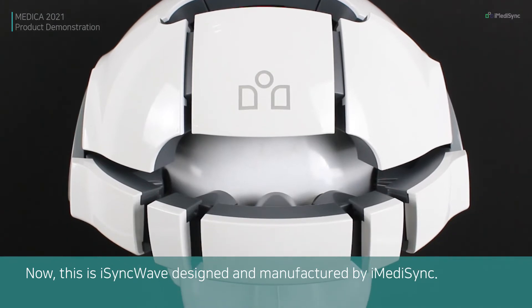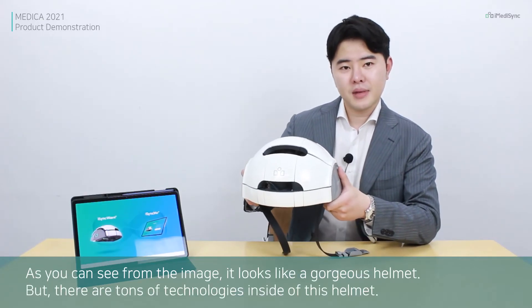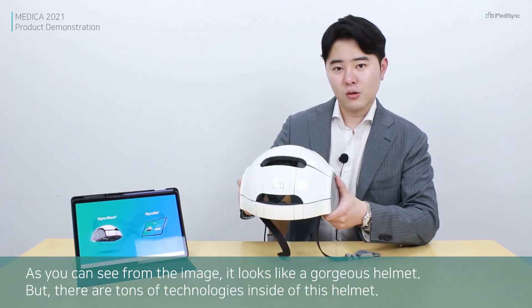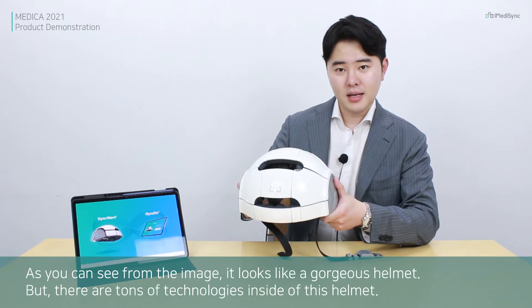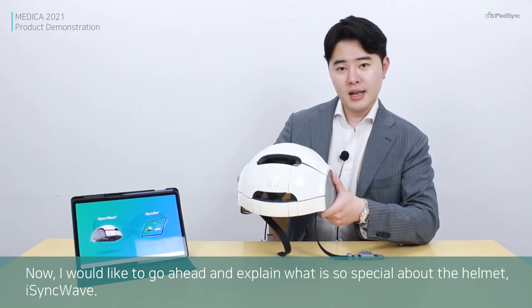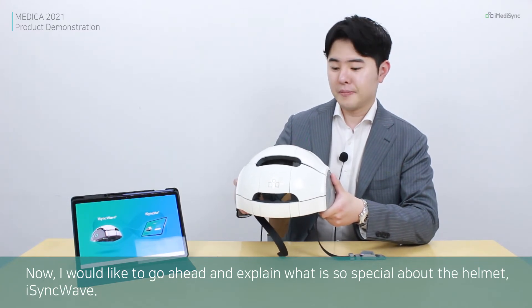This is iSyncWave, designed and manufactured by iMediSync. As you can see, it looks like a gorgeous helmet, but there are tons of technologies inside. I would like to explain what is so special about the iSyncWave helmet.